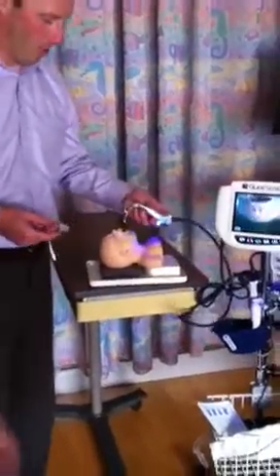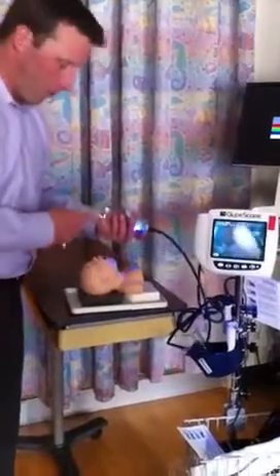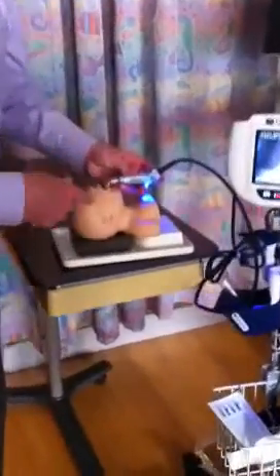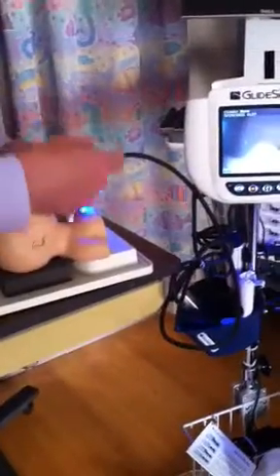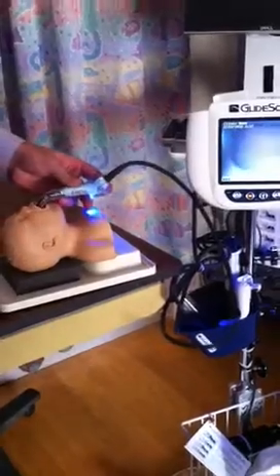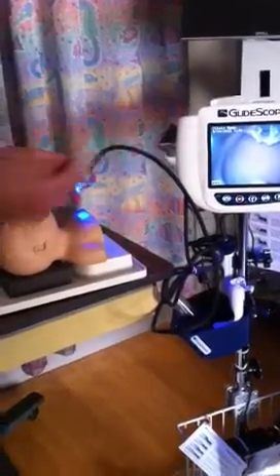The fourth step process is to insert the blade into the patient's mouth, look directly into the mouth, make sure the tip makes it around the corner, and once you get it around the corner it disappears. Then you're going to want to get your bearing on the monitor itself. You can see your uvula right here, so you know you're right down midline. Once I get into that view, I'm going to then kind of rock back just to get a better angle of the cords.